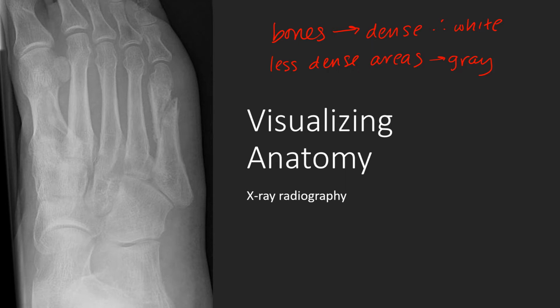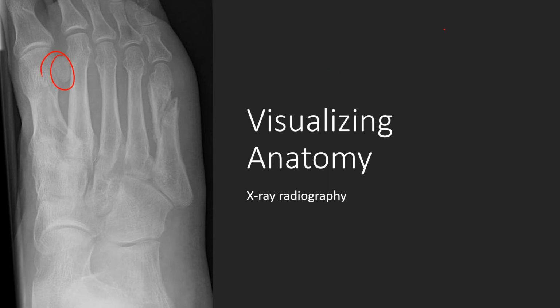Okay? There's two things that stand out to me that you shouldn't need to know anything about the bones of the foot to be able to deduce, except for what I just showed you. First of all, what the heck is that guy? You have this pebble thing sticking in there by your foot. That looks weird. Now, as it turns out, that kind of thing is totally normal, but it doesn't look like the other bones, so it's something that should attract your attention.